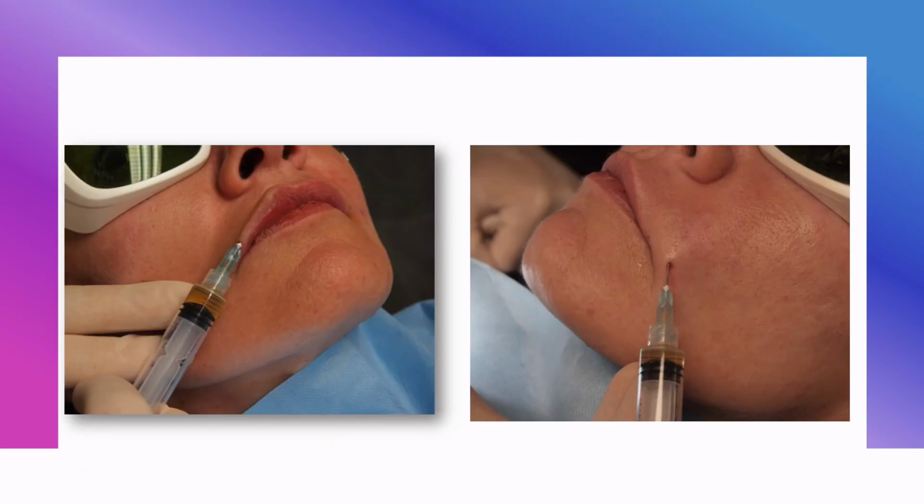After this first laser passage, further cellular metabolism biostimulation can be obtained with a PRF filler application, with a completely autologous and biologically natural outcome. PRF is in this case properly injected through a cannula technique to elevate the nasolabial wrinkles and to obtain a moderate and natural volume increase of the lip contours.